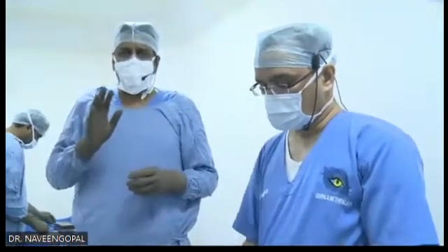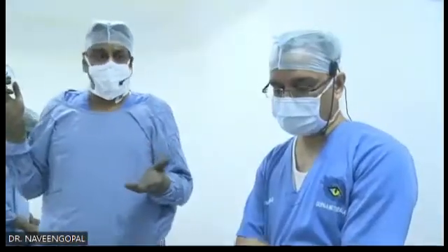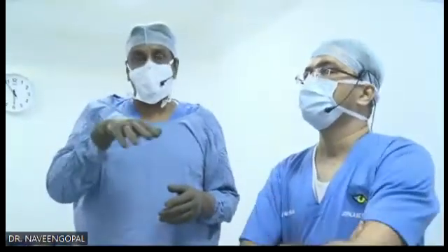Now we'll have a sort of panel discussion before I go to my multifocal. Any doubts you have regarding... Have you ever had to remove an ICL? Yes, I have had to remove the ICL because it has gone the other way a couple of times.